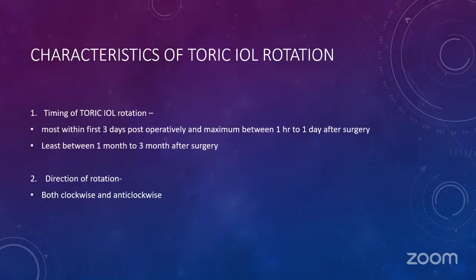Various studies were conducted, and a consensus of various studies was found, and then they put up various points as to why the toric IOL gets rotated and what are the factors contributing to it. So we'll be going through them one by one.